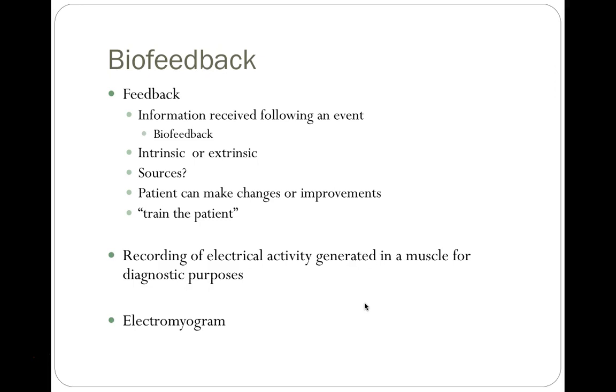So again, if you're doing more advanced biofeedback with an EMG, you would potentially get a graph that shows the increase in electrical activity and how that comes on and how that plays out, and you can see that in graph form. We're going to be able to see it in the form of lights or hear it in the form of auditory response.